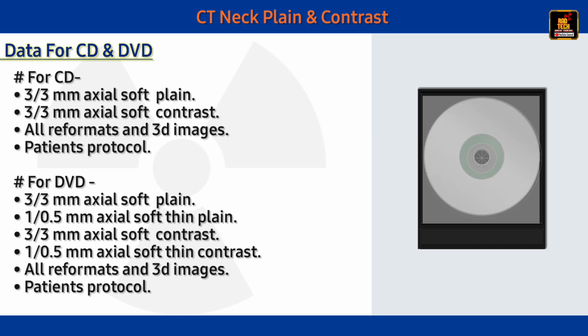Patient's protocol. In DVD you can give thick and thin data like 3 by 3 mm axial soft plain, 1 by 0.5 mm axial soft thin plain, 3 by 3 mm axial soft contrast, 1 by 0.5 mm axial soft thin contrast, all reformats and 3D images. Patient's protocol.